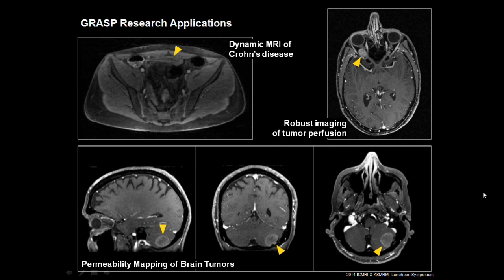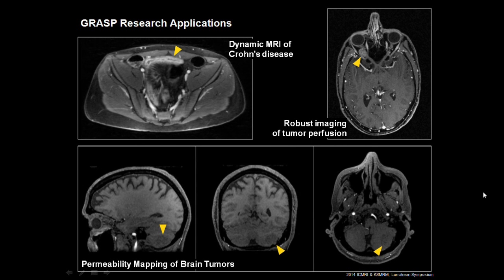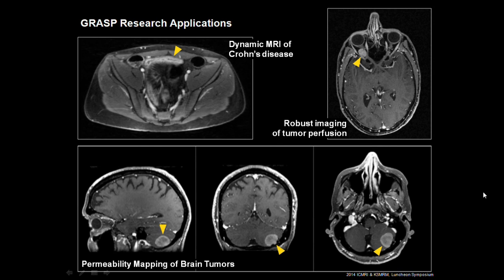And of course, then there's the whole field of permeability mapping of brain tumors. We just started looking into this field, but this shows the image quality that we can get in this application.